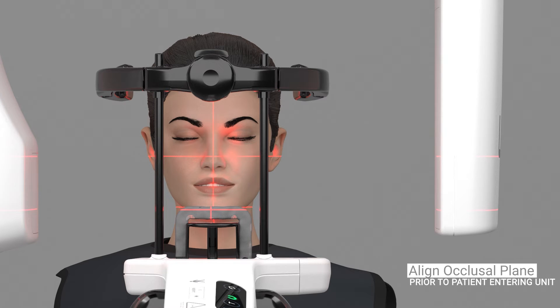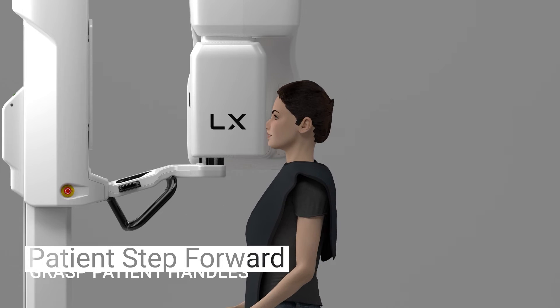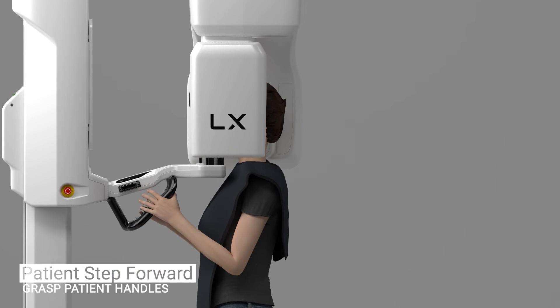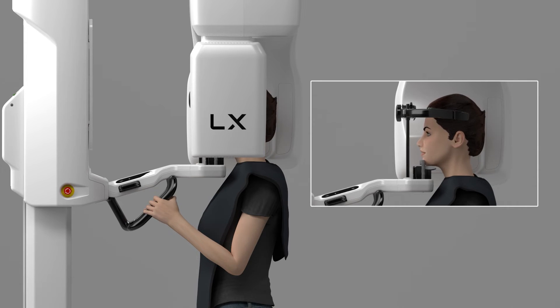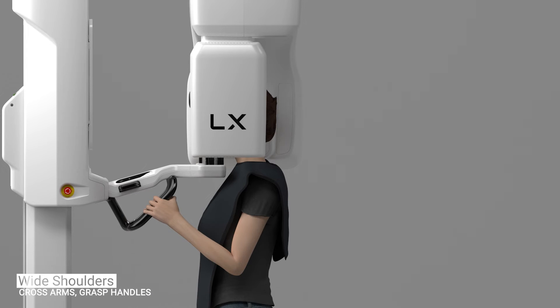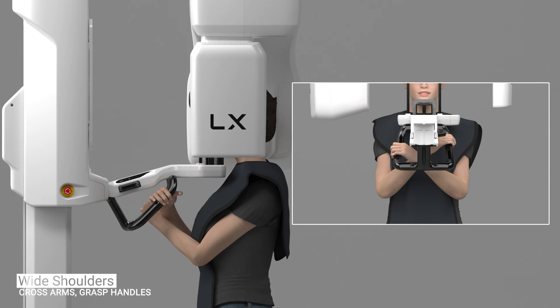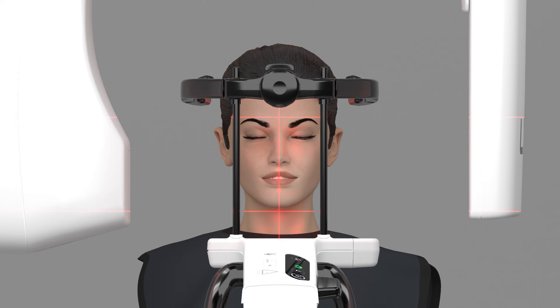Use the horizontal alignment lights to ensure the patient's occlusal plane is horizontal. Have the patient step forward, asking them to grasp the patient handles, place their chin on the chin rest, making contact with the lip support. If the patient has wide shoulders that could collide with the rotating unit, ask the patient to cross their arms when holding the handles to contract the shoulders. If you are taking a 15 by 20 field of view image without a chin rest, use the horizontal lights to determine the correct height for the head support and patient's head.